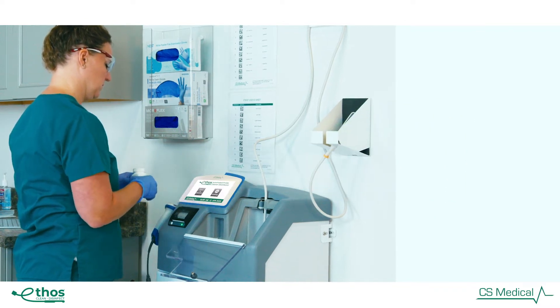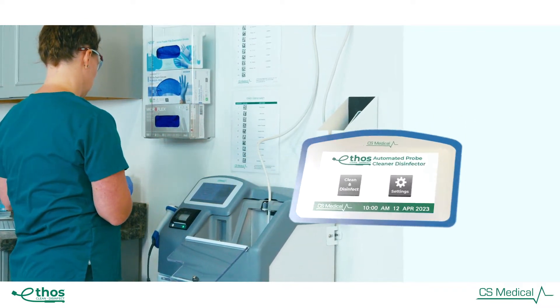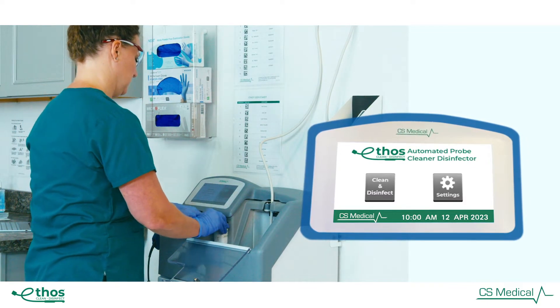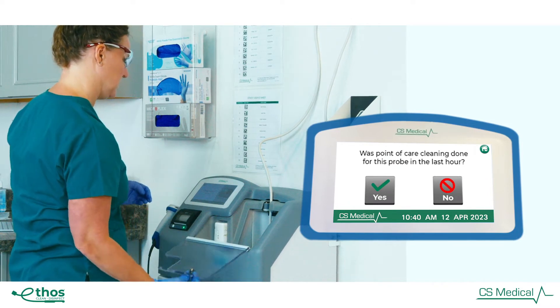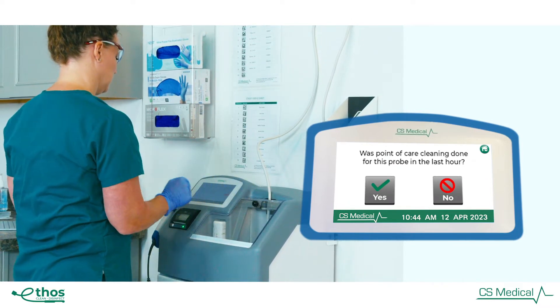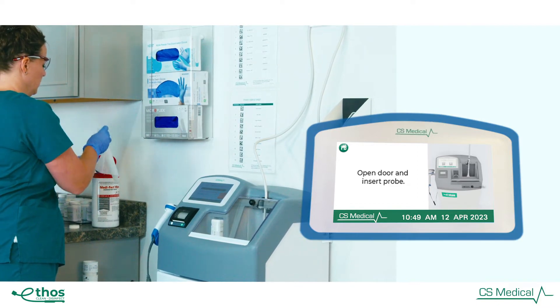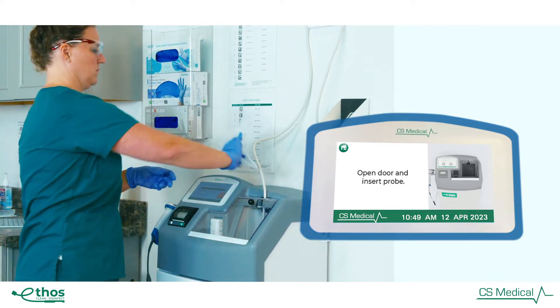The 7-inch LCD screen allows for simple operation of the device. Process flow animations allow the end user to reprocess a soiled ultrasound probe easily and effectively. The on-screen instructions ensure smooth and effortless reprocessing for each soiled ultrasound probe.